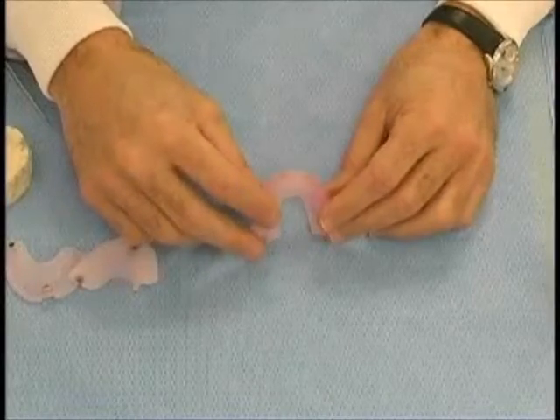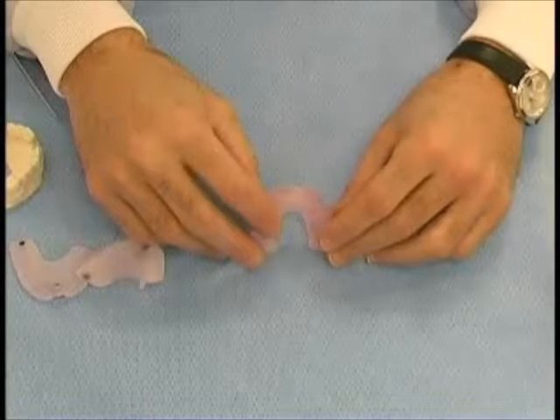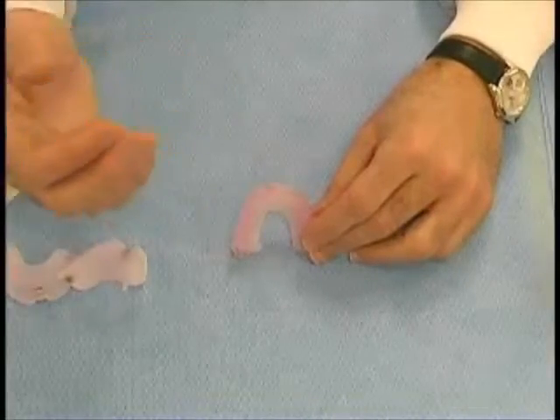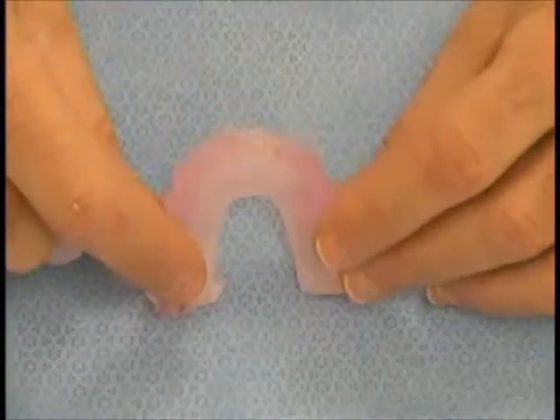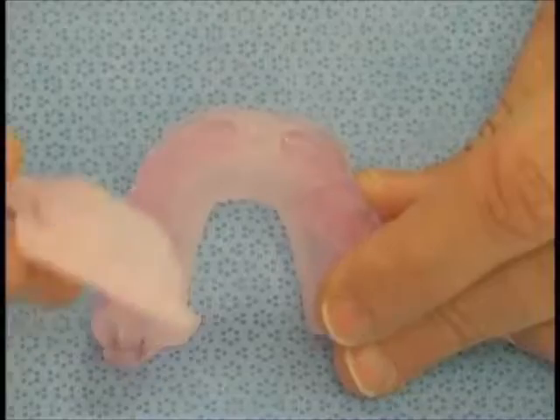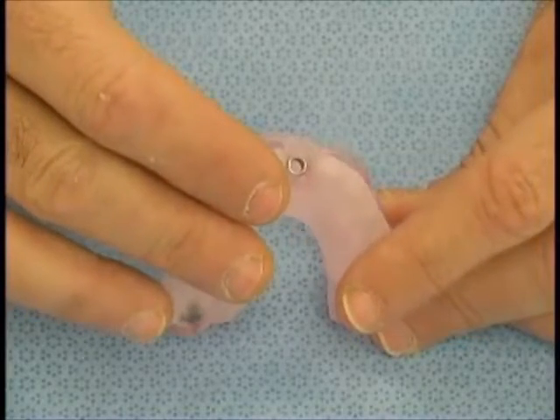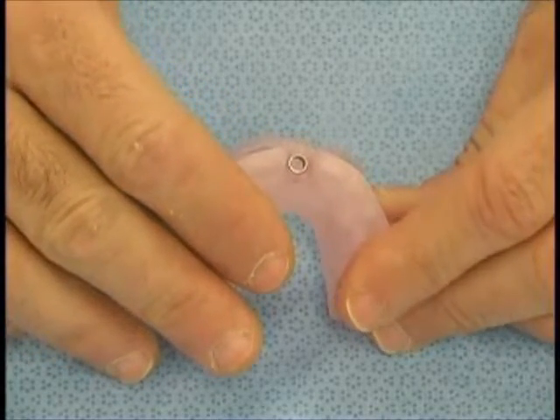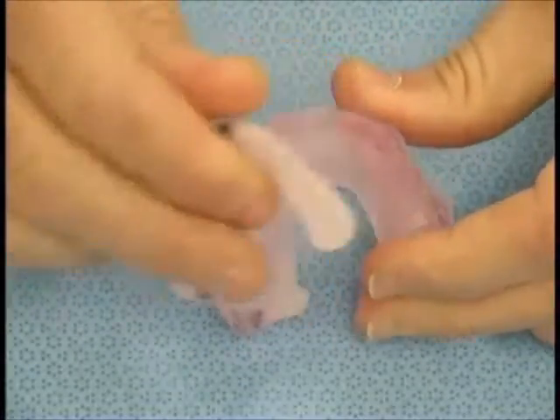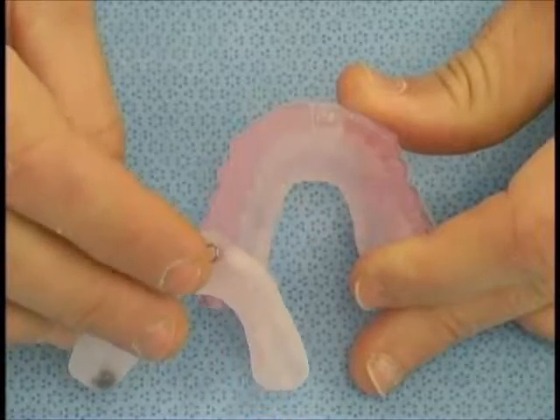The whole idea of any teaching program is to not only go through the didactic explanation of techniques and procedures or show slides, but also to give the participants an opportunity to actually utilize a hands-on approach, even if it is on a stereolithic model. The great thing about such a stereolithic model is that you can actually do the surgical procedure ahead of time and experience it in all its components, so that when you get to the actual clinical procedures, all the components are familiar. The angles that you would use sitting next to the patient should be utilized in the same way when you're doing it on the lab bench.